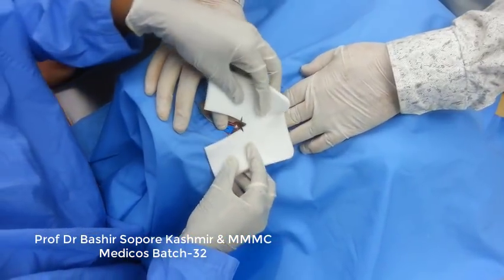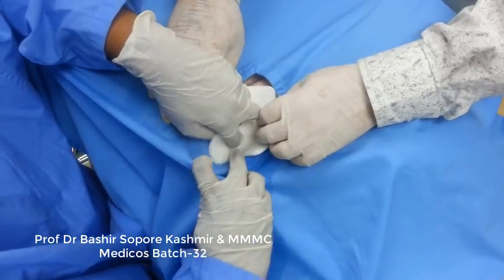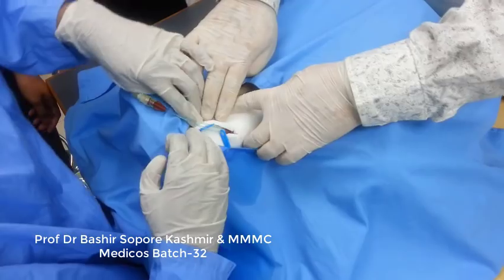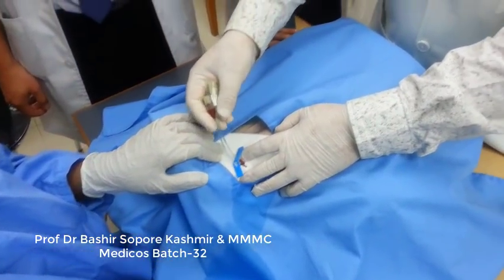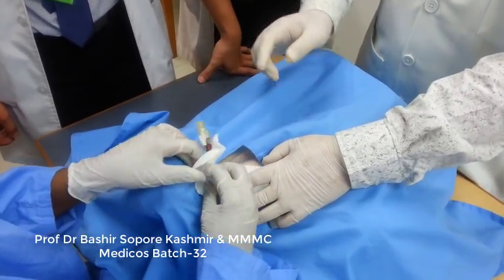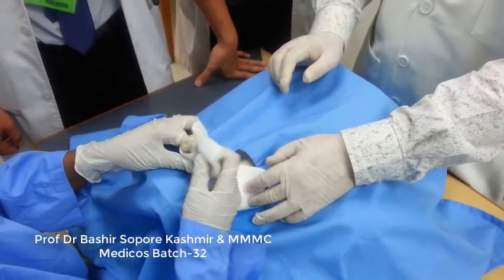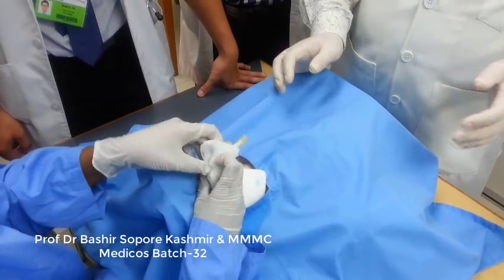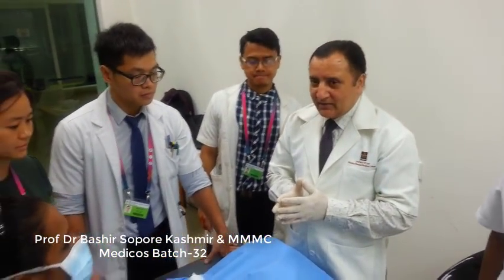Now you can put the dressings like this. You got my point? Then this can also be covered by the gauze. You can cover it by the gauze. This is how we do the central venous catheterization. I think we have completed all the steps. We have not left any step, right?